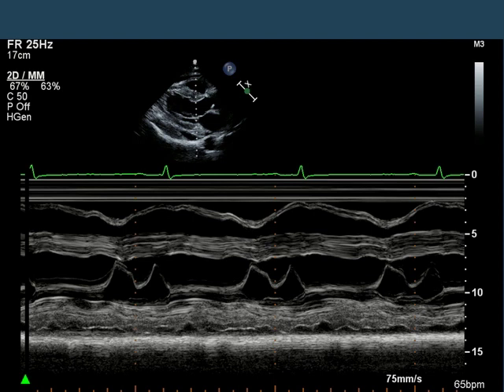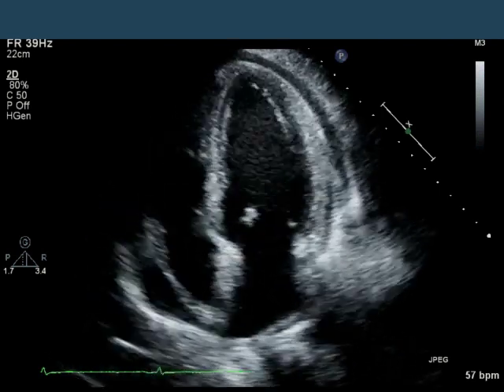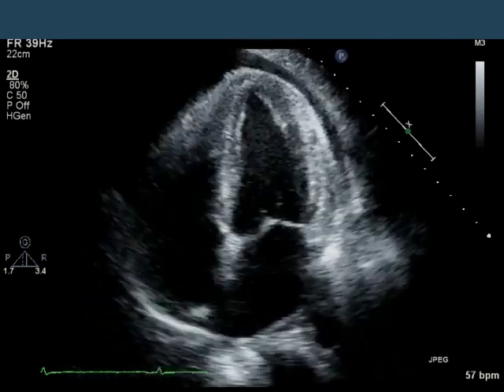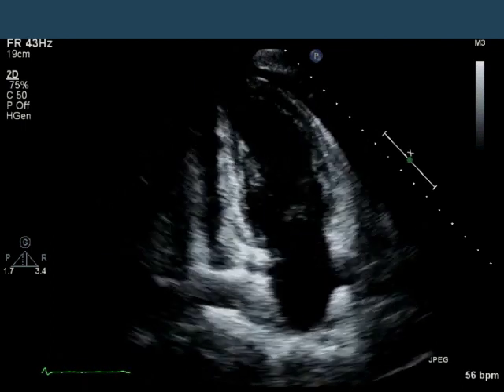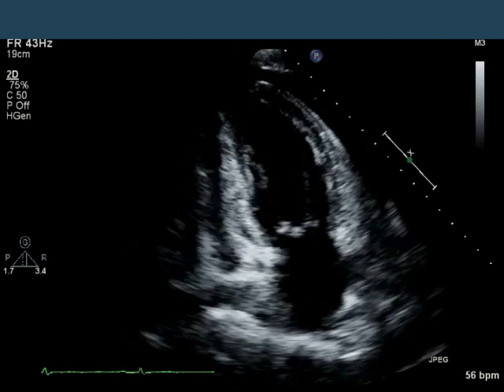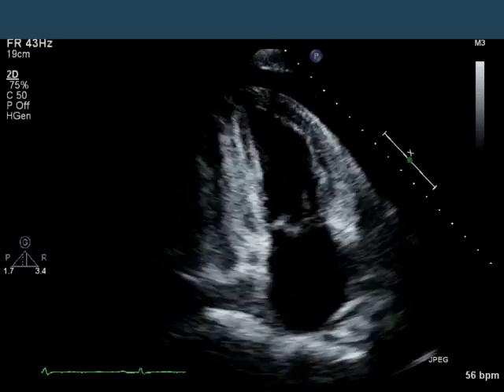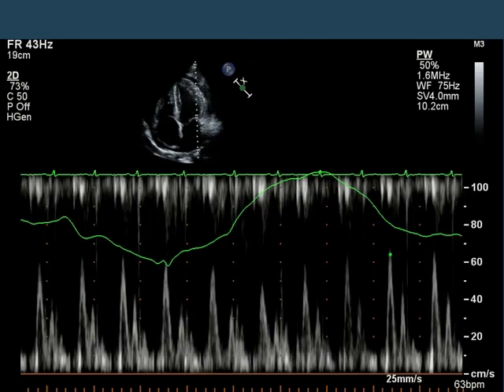There are both 2D and confirmatory M-mode findings demonstrating tamponade physiology. Take a look at this apical four-chamber view. You can see that there is a circumferential pericardial effusion. The function of the RV and the LV appear to be normal. If you look at the two-chamber view on the next slide, you can see that the anterior and inferior walls appear to thicken normally, and note again the circumferential pericardial effusion. The next slide demonstrates pulse wave Doppler through the mitral valve, and you'll notice significant respiratory variation in the mitral inflow. During inspiration, the mitral velocities are reduced; during expiration, the mitral velocities are higher.